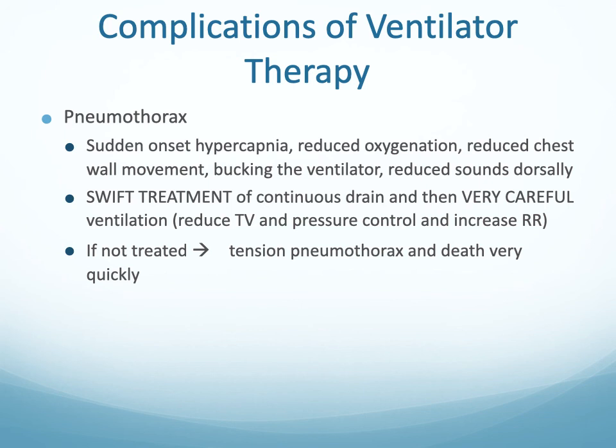If you notice your patient is bucking the ventilator, so not breathing with the ventilator, and you're noticing that the chest is not moving very well, and you've got a sudden onset of really high carbon dioxide and markedly reduced oxygenation, if you pop your stethoscope on and you can't hear any lung sounds at the top dorsally, that's quite classic for a pneumothorax.